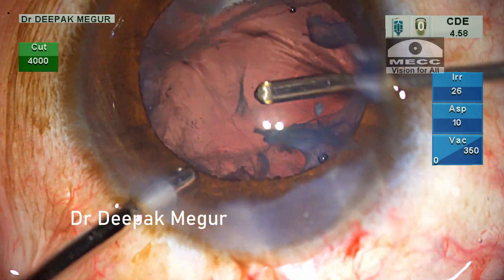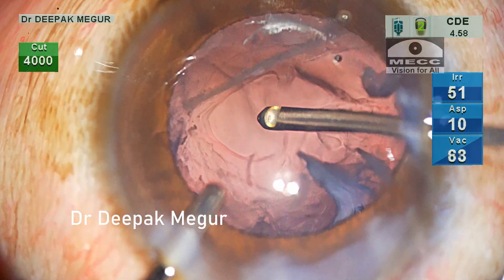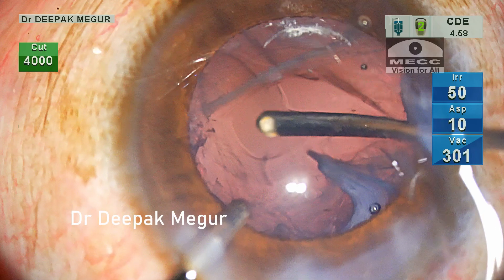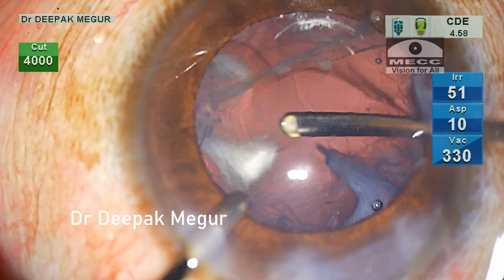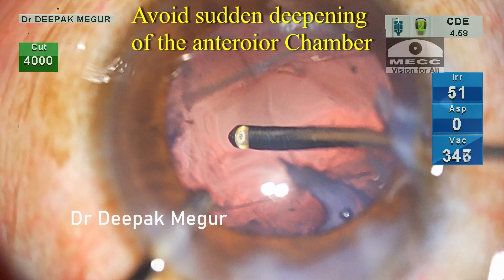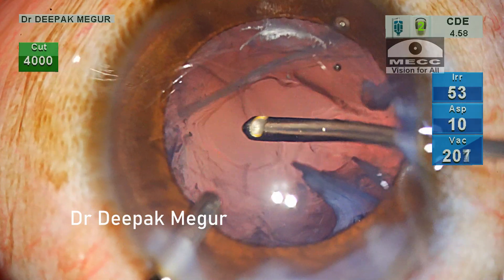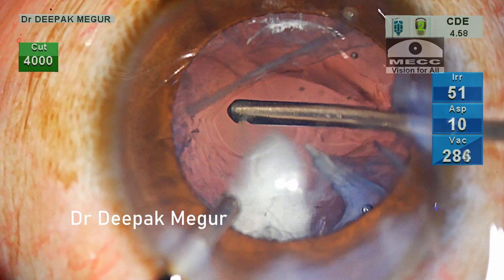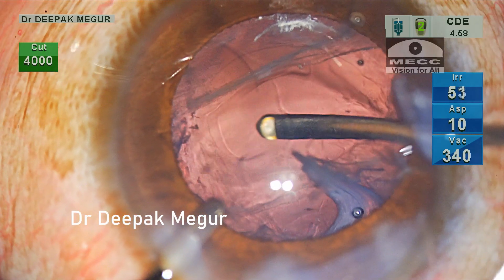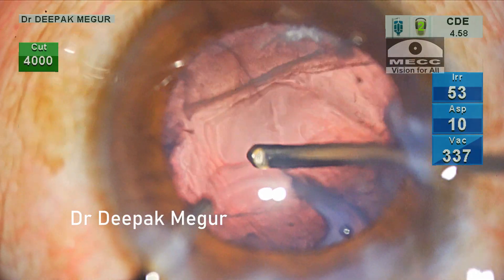Now I introduce my irrigation cannula. Please note the bottle height as I begin the vitrectomy — it's kept very low initially because there is already a lot of OVD in the chamber. Once the chamber begins to get evacuated of the OVD and vitreous, the bottle height is then gradually increased. The idea is to avoid sudden deepening of the anterior chamber when entering with an infusion cannula at a high bottle height. Once the anterior vitreous is removed, the cutter is rotated sideways and posteriorly to remove the surrounding prolapsed vitreous, performing just a limited anterior vitrectomy.